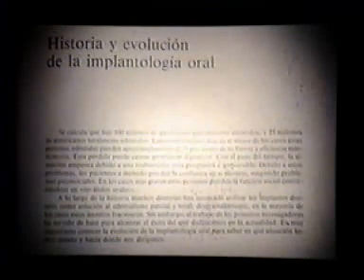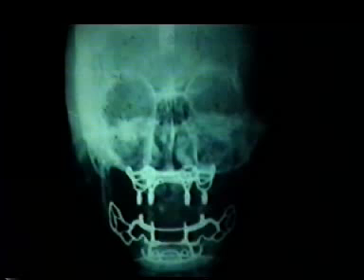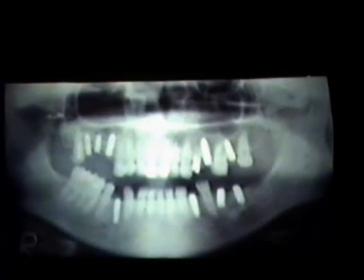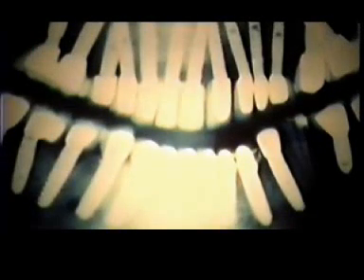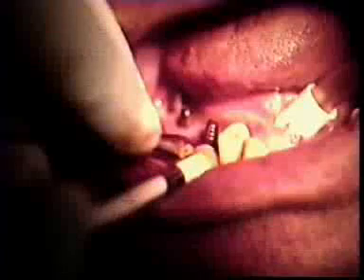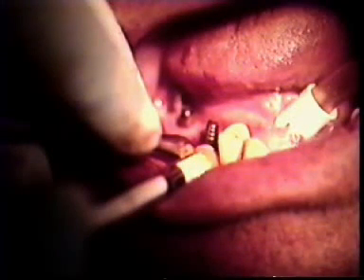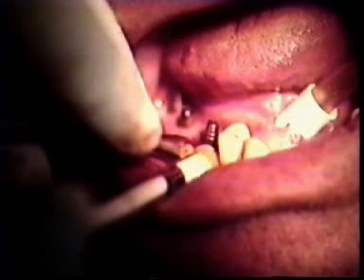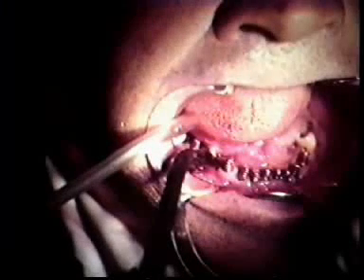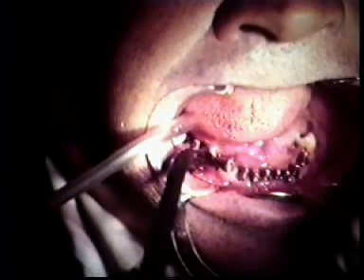Since that time, men dreamed with the realization of their first individual implants. In 1981, I made this kind of implants. In 1991, I realized my dream, putting one implant in each lost root. And this is my case of 27 implants in a total rehabilitation using the ECVOS implant system. We put one immediate implant where the second bicuspid was extracted. We filled the socket with synthetic bone and tetracycline. We use the laser application again.